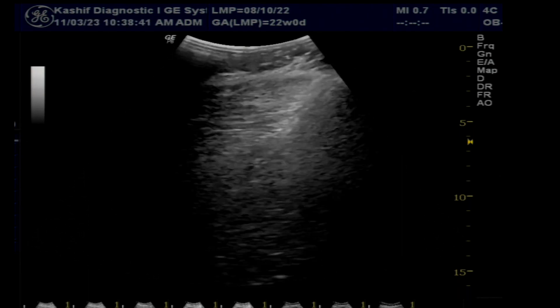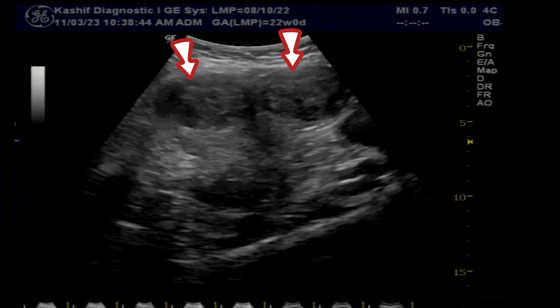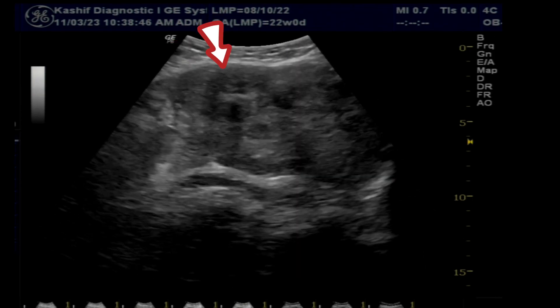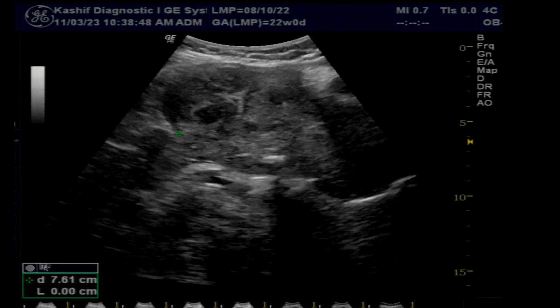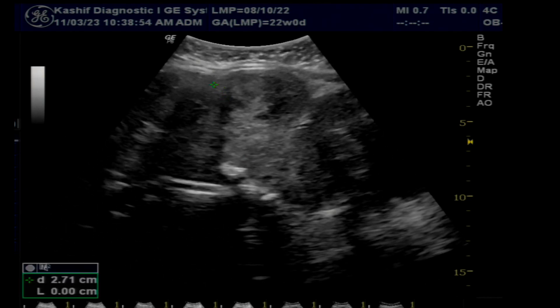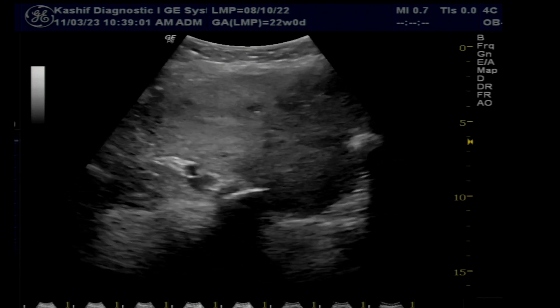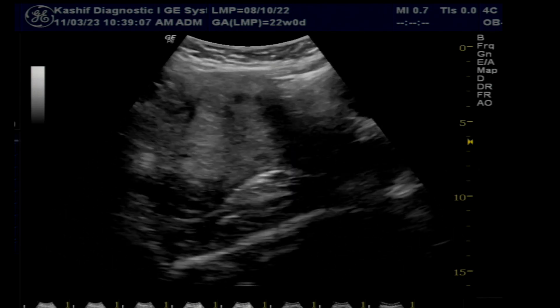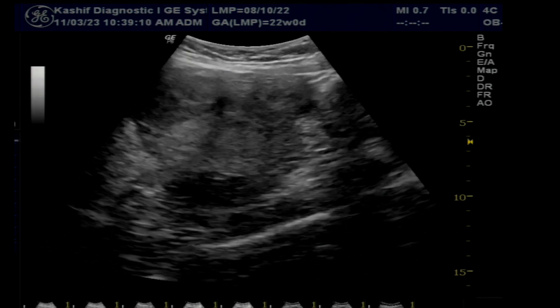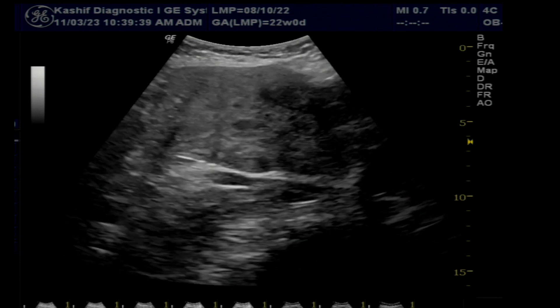Multiple intramural fibroids are seen anteriorly and posteriorly. A large fibroid is seen in the low uterine segment and cervix. A calcified fibroid is seen in the posterior wall. These multiple fibroids are enlarging the uterus and coarsening its texture.